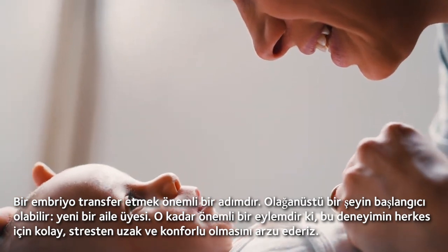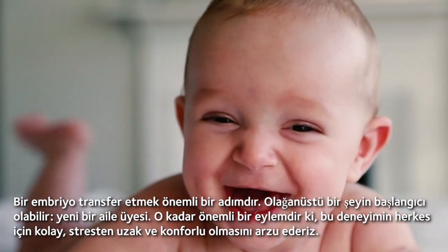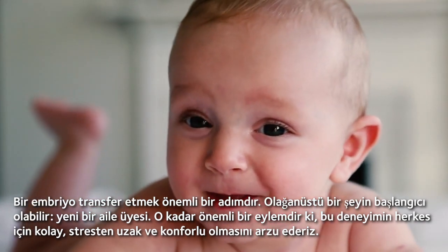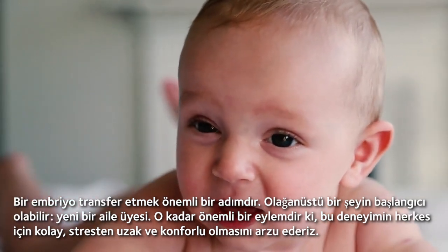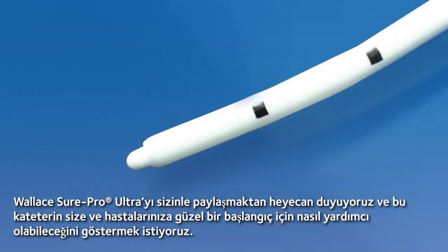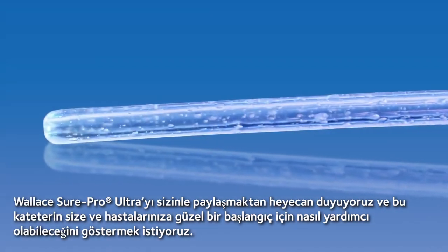Transferring an embryo is a monumental step. It could be the start of something incredible — a new family member. It's such an important action, so we want this experience to be easy, stress-free and comfortable for everyone. We're excited to share the Wallace Sure-Pro Ultra with you and show you how this catheter can help you and your patients have a beautiful beginning.